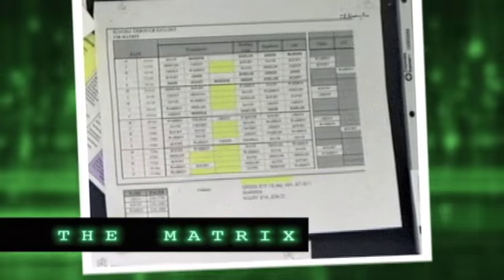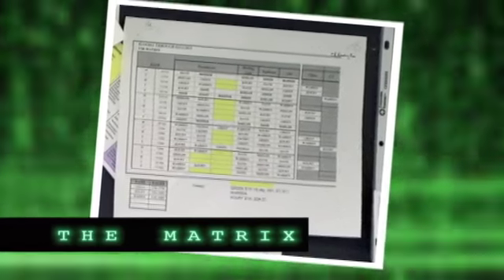The matrix is actually a fancy name for a schedule. On it, you'll see what your job is each day. It'll also tell you when it's your turn to run the list. Now let's step out into the procedure hallway and we'll talk about hats and shoe covers.